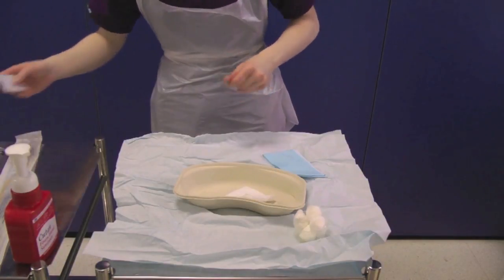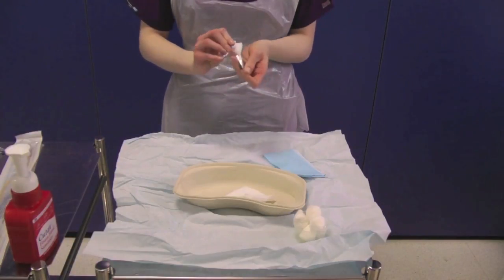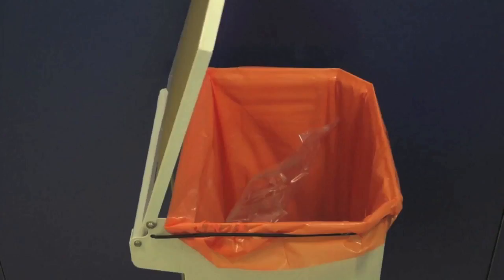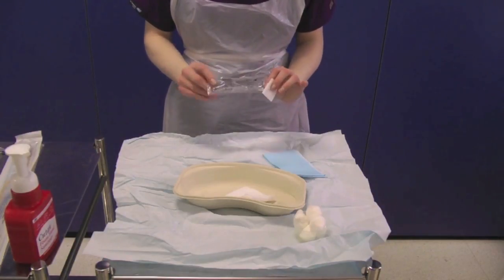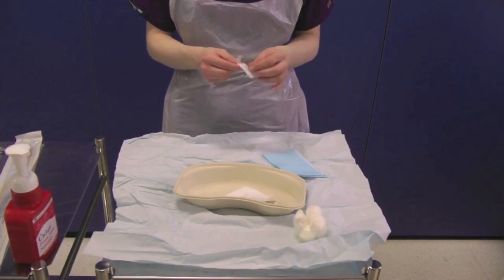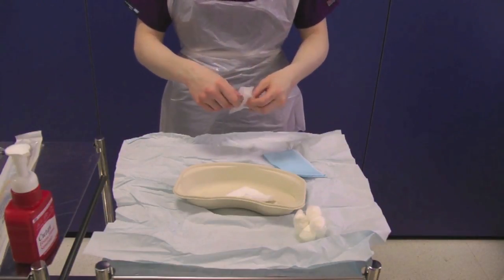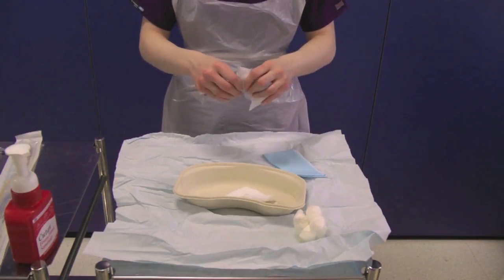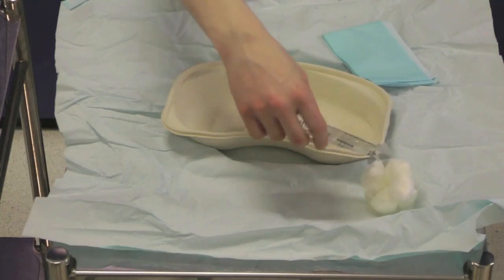Take your first chlorhexidine wipe and check that it is in date. Also check the expiry date of the saline sachet. Clean the top of the normal saline packet and open, pouring the saline into the pot. Repeat this process for the second saline packet.